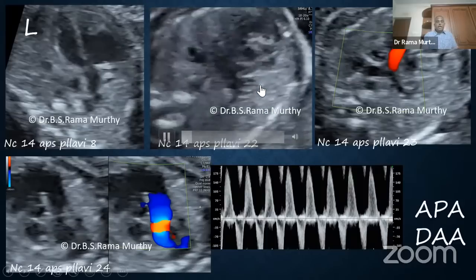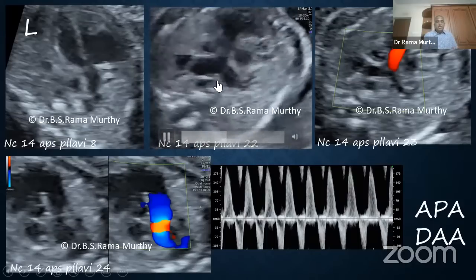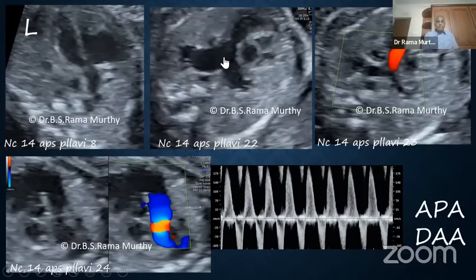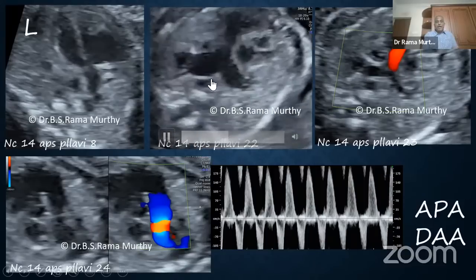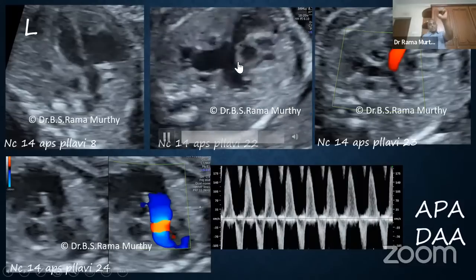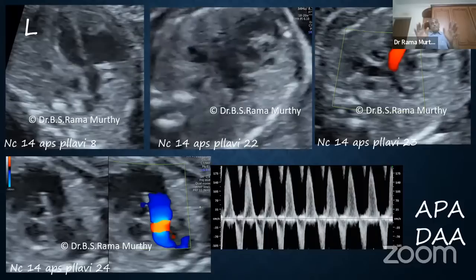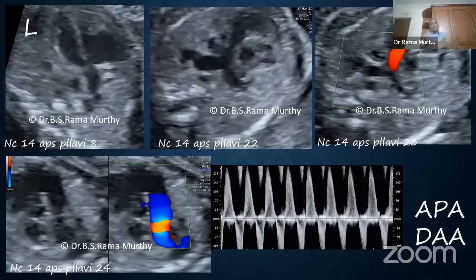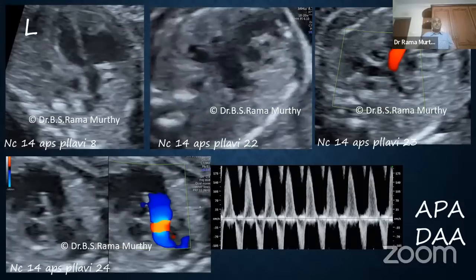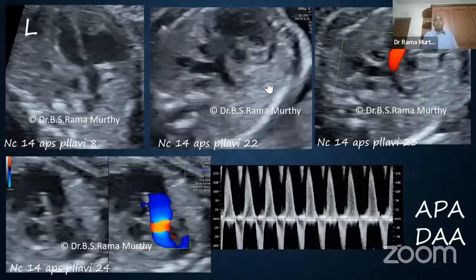Naturally, I am quite curious. Is there a crisscross? Definitely there's a crisscross. Why is that? Because this is the long axis of the pulmonary artery matched with the short axis of the aorta. So if the long axis of one artery is matched with the short axis of the other artery in the same plane, these two arteries must be mutually perpendicular. Simple. It's just a spatial concept which all of us have to recognize.